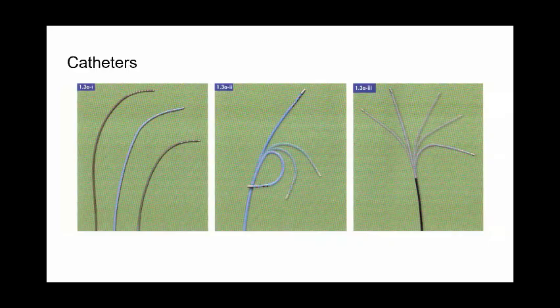It's very similar to many of you to the use of temporary pacemaker wire. If I have a patient with complete heart block or a patient doing coronary intervention with bradycardia, I insert temporary pacemaker. This temporary pacemaker is inserted in the right ventricle and connected to a battery outside or a device outside to control the output and control the heart rate.